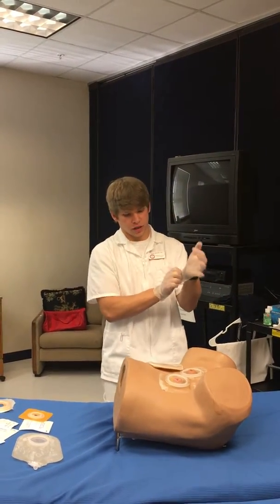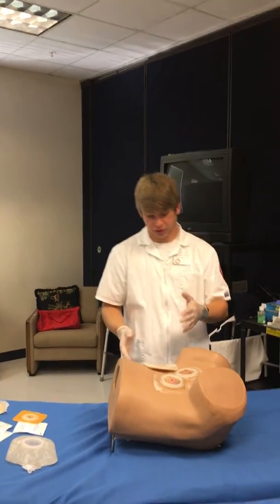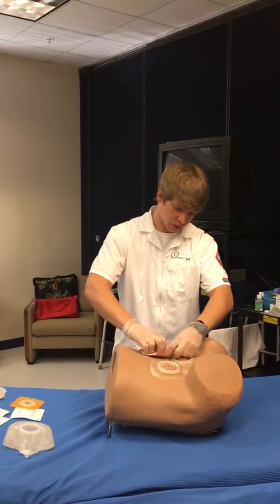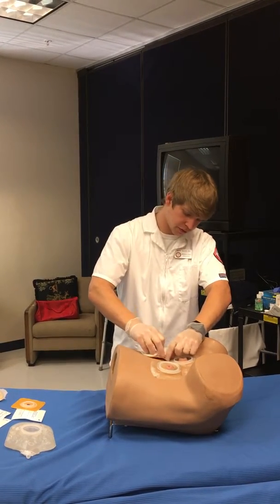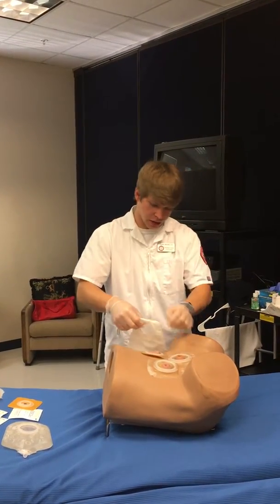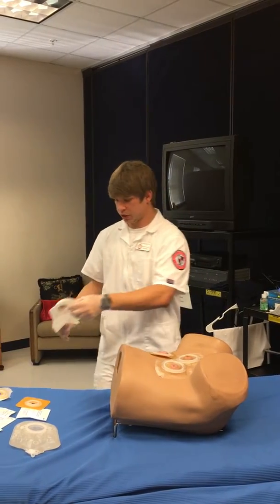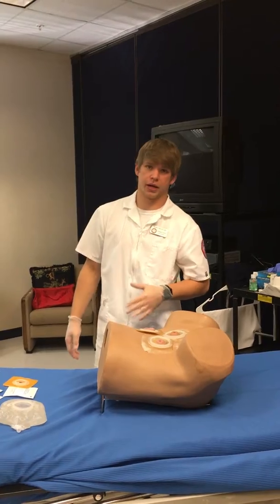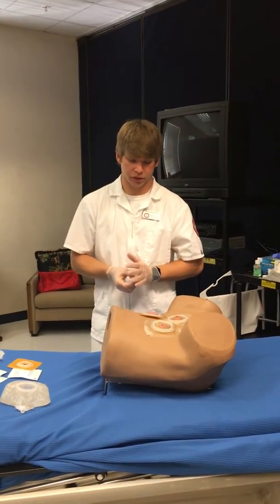Next, put on clean gloves and come up to your patient. Check the stoma they already have, then come up and remove the old one — ask them how it's feeling, and you'll hear it unclip. Take it, measure it, document it, and discard it. You'll either empty the bag or change the bag, depending on when it was time to change it.